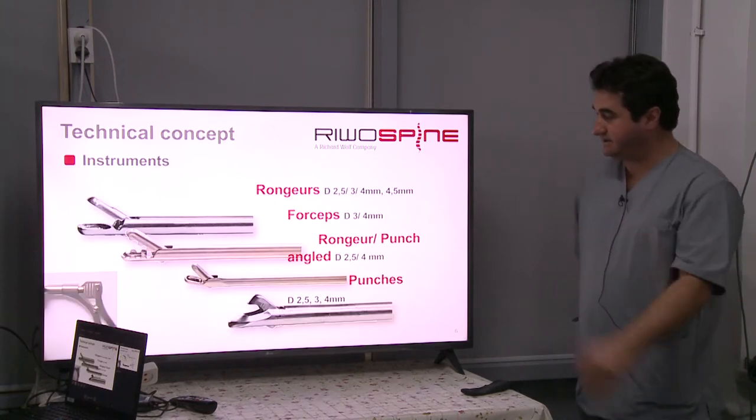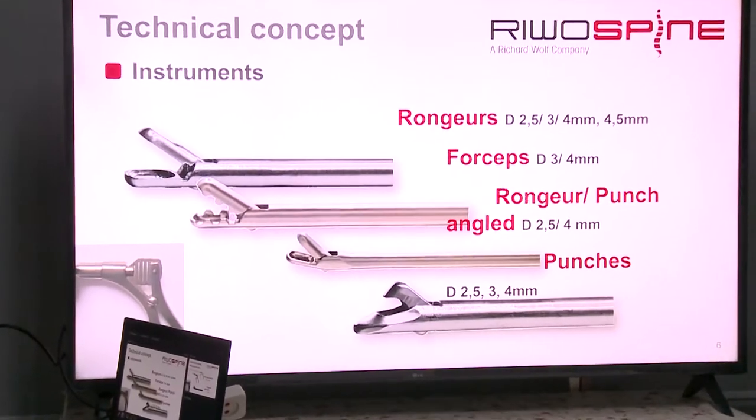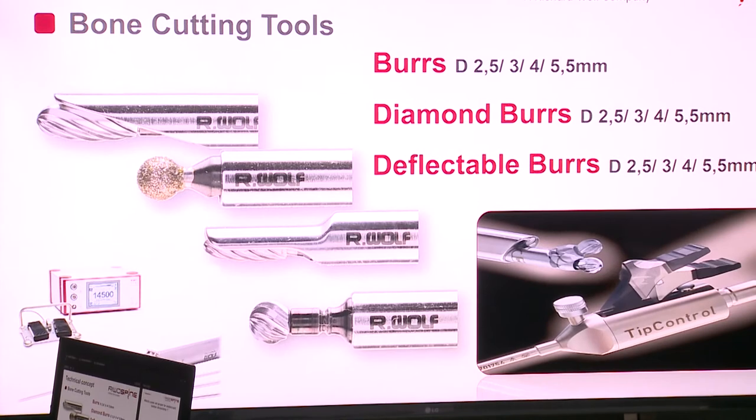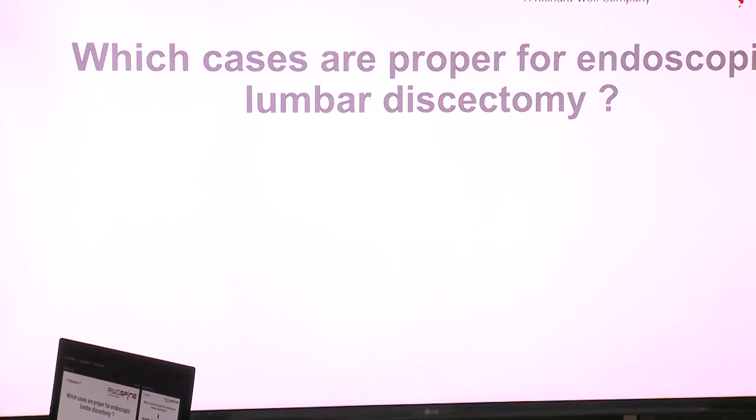And we have different types of rongeurs, as you've seen in the operation: scissors, rongeurs, punch, angled ones, Kerrison rongeurs and deflectable ones. And we have different types of burrs with the system here.